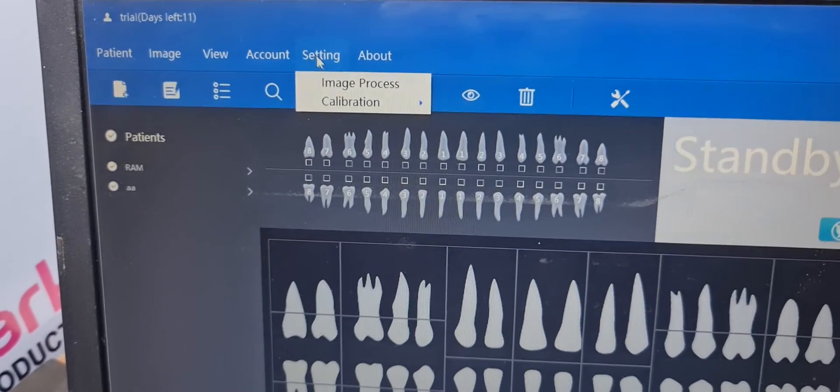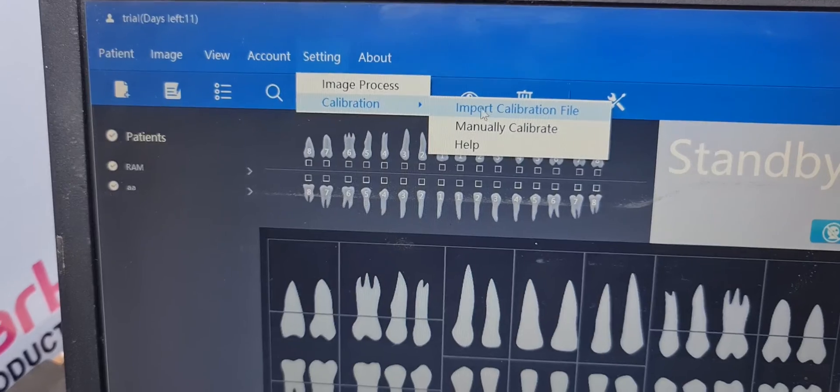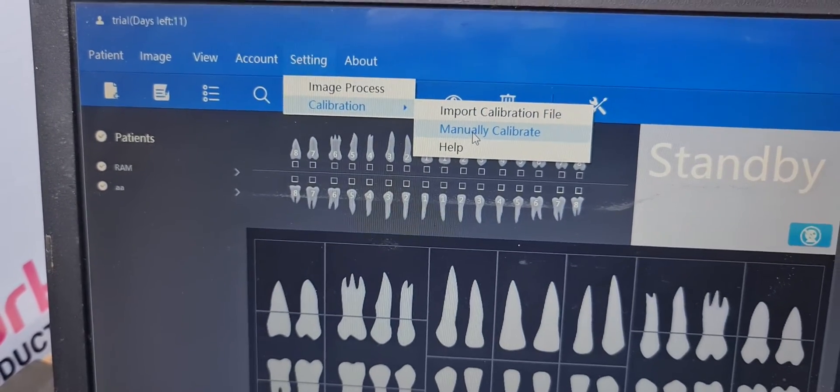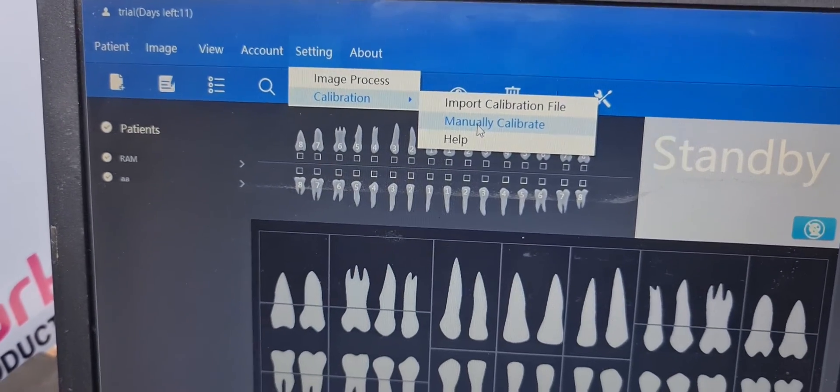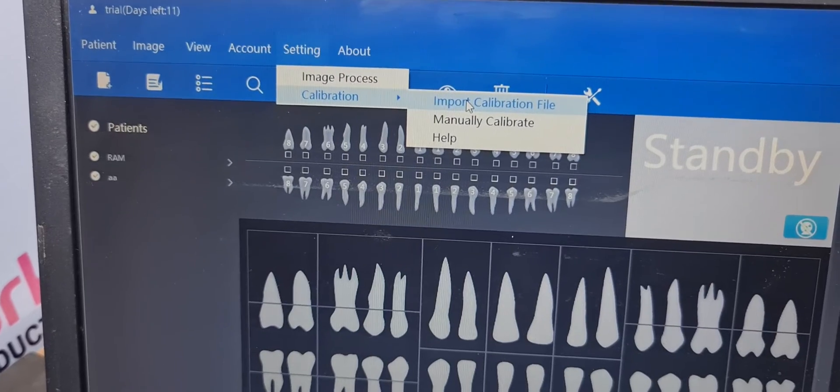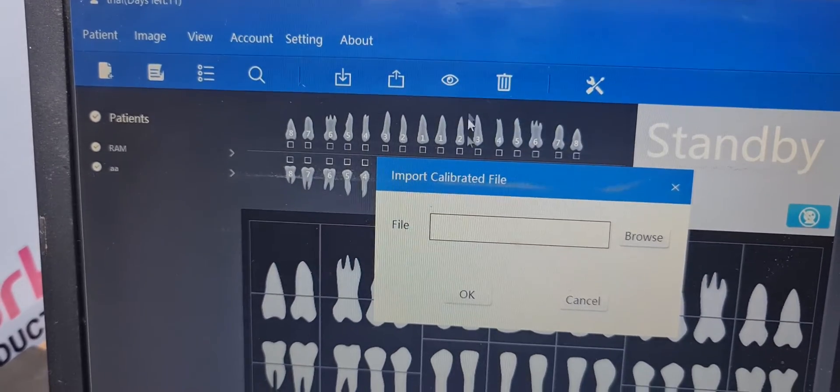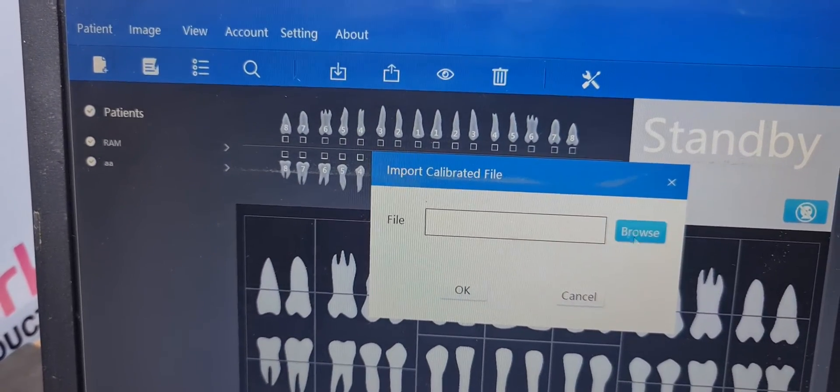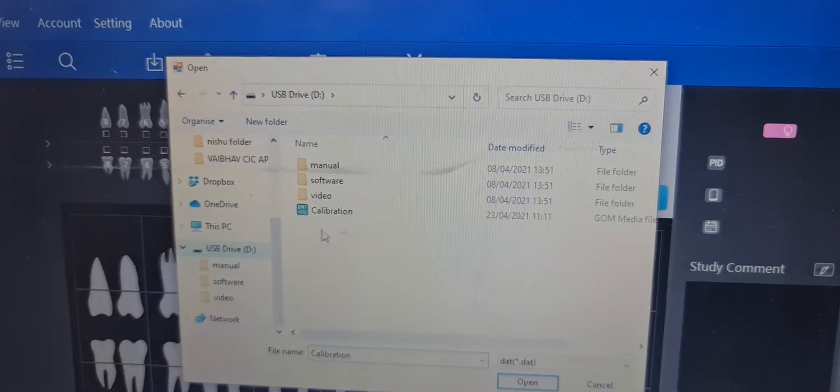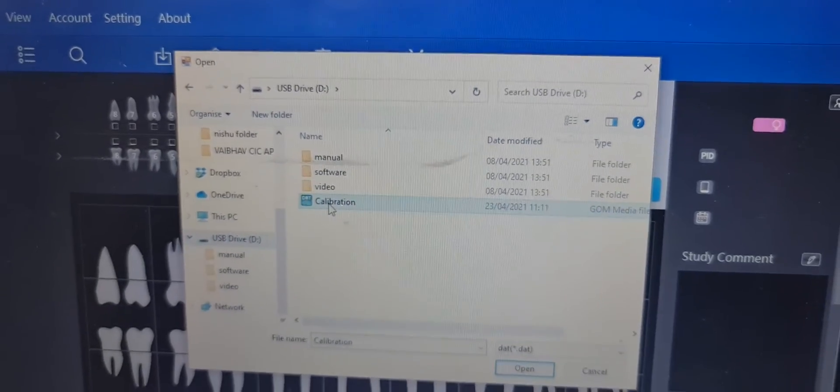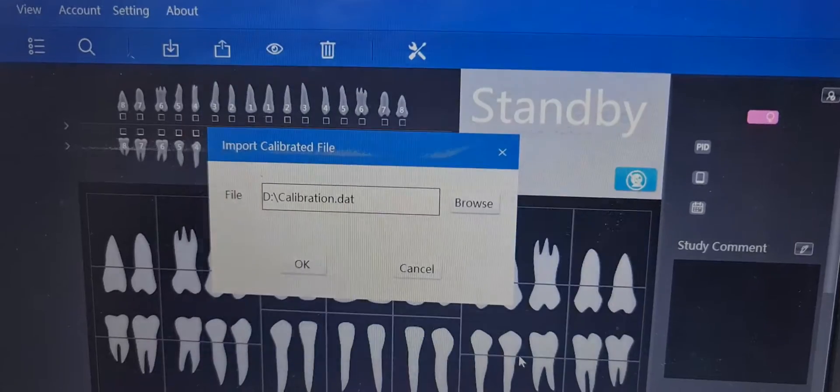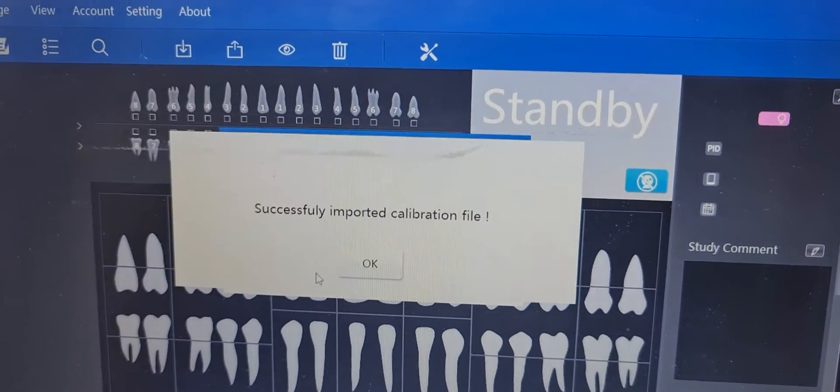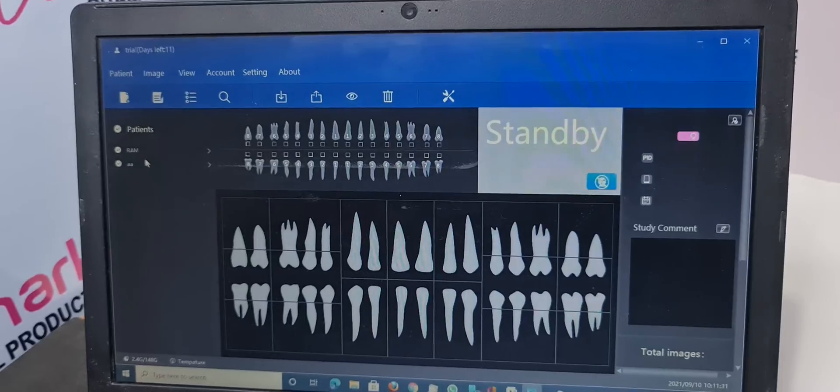Now go to settings, calibration, manually calibration which I told you before with the aluminum plate. If you want to calibrate directly, go to import calibration file, browse, go to USB disk, there is a calibration file, select this, open, OK. Now your sensor is calibrated.